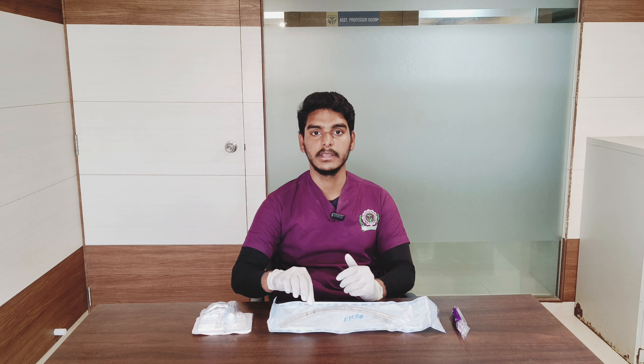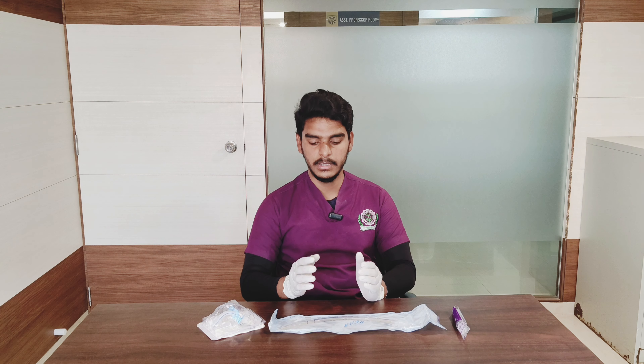There are various types of artificial airways. Some are inserted through the nose — nasopharyngeal airway. Some are inserted through the mouth or oral cavity; for example, the endotracheal tube. Some are inserted through a hole in the trachea after a procedure called tracheostomy — we have the tracheostomy tube. However, this video will be confined only to the endotracheal tube and the tracheostomy tube.